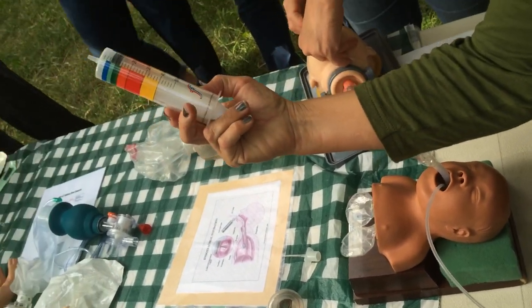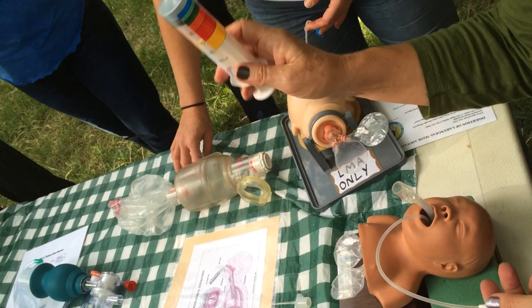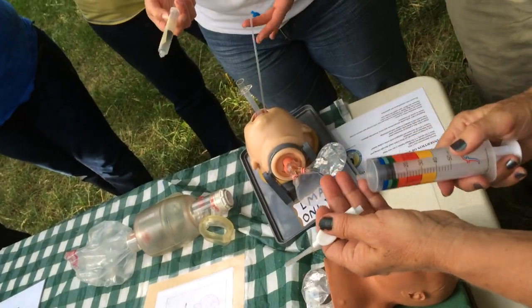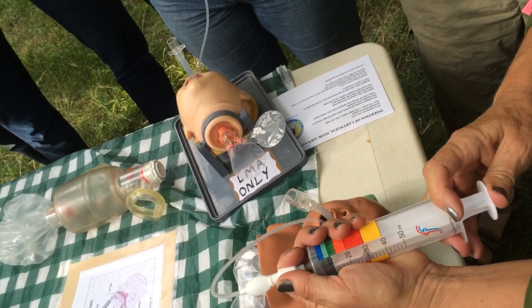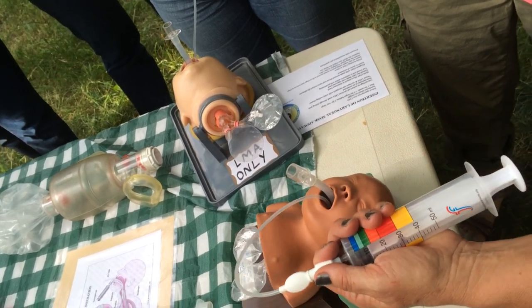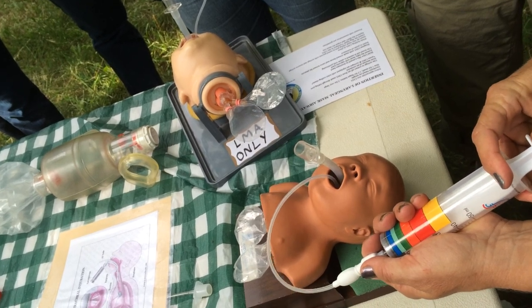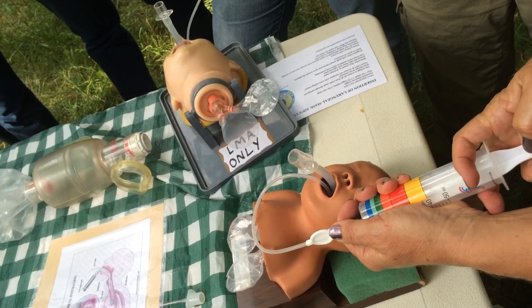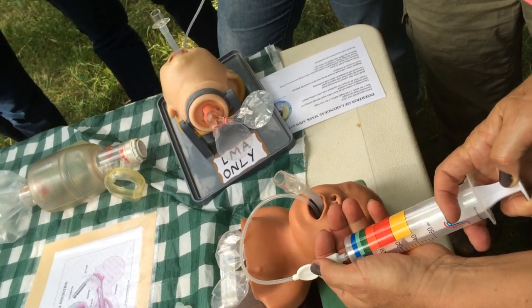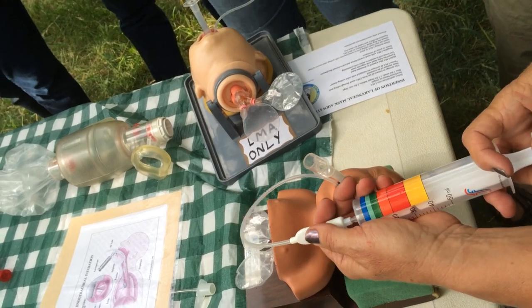And then look at how much air you took out. I think yours are 4.5 or 5 and mine is about 4. So you're only going to put in about 1/2 to 3/4 of what you took out. And watch what happens if you put it all back in. See? Did you see it jump up? It jumped up because it came out of place because you put in too much air. It should not get its capacity of air, but rather about 1/2 to 3/4.